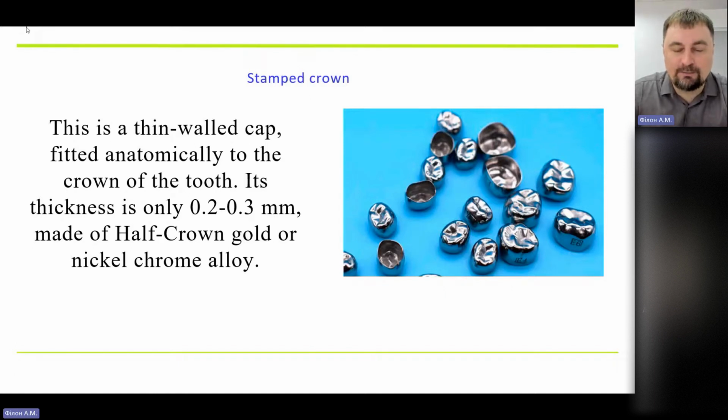such gold crowns, but look at this picture, it's metallic stamped crowns, not gold, when the patient is using these crowns, biting on them, later this material, because it's soft, is going to break. And when you check on it in 10 or 15 years of use, you can find windows, like holes in those crowns because of biting, and you have to change those crowns, of course.